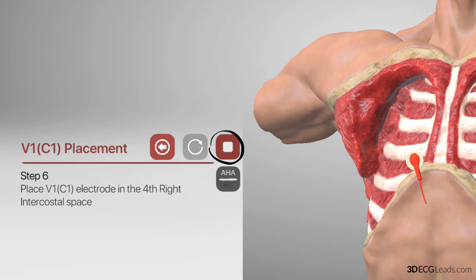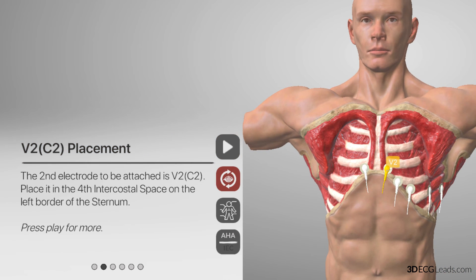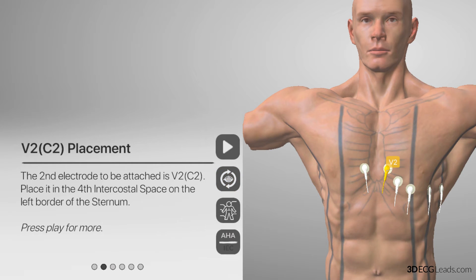So stop the animation now by pressing the stop button. We will move on to the second lead placement. The second lead to be placed is V2, and it is placed in the fourth intercostal space on the left border of the sternum. It is identical to the method shown for placing V1, and the steps will be repeated, but on the left side. To view the V2 demonstration, press play for the placement technique.